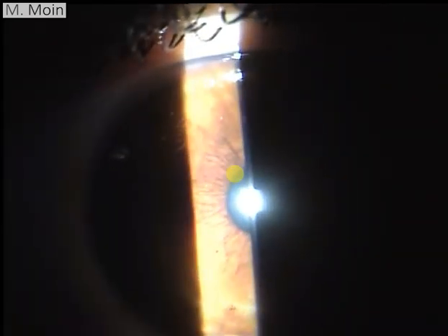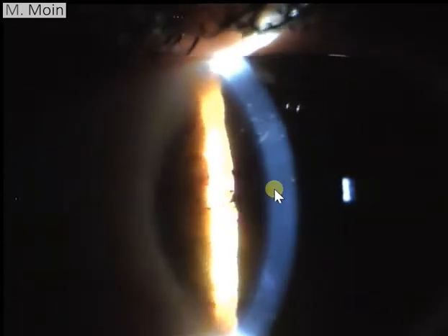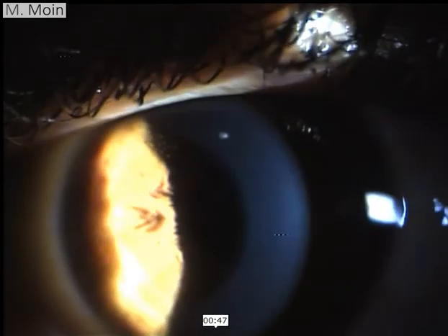With newer femtolasik, the flaps tend to heal better and sometimes become imperceptible. But this was probably done with a microkeratome, and the patient recalled some problem with the microkeratome during surgery. When we go over to the other side, you will see there were some issues with the flap on that side as well.